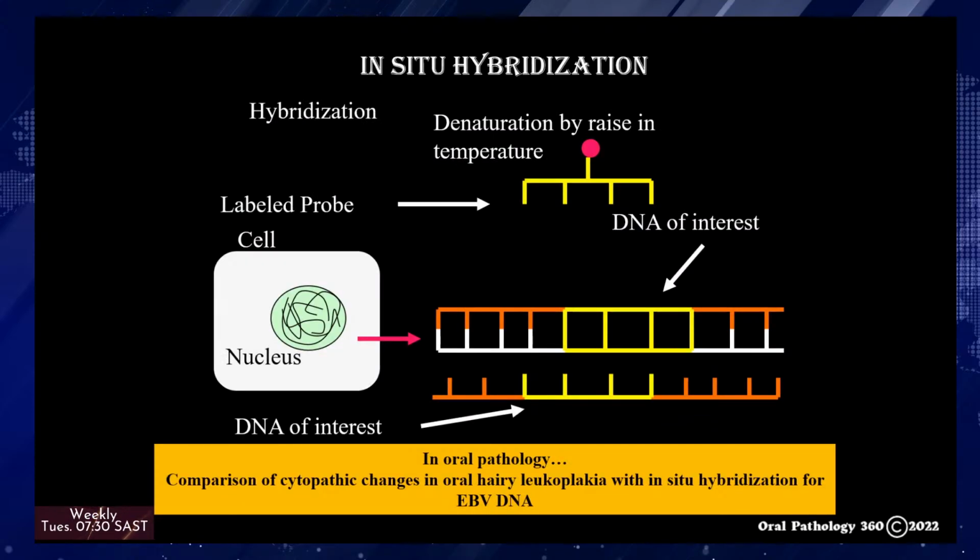In situ hybridization is a type of hybridization that uses a labeled complementary DNA or RNA strand to localize a specific DNA or RNA sequence in a portion or section of tissue, or if the tissue is small enough, in the entire tissue. This is distinct from immunohistochemistry, which usually localizes proteins in tissue sections. DNA in situ hybridization can be used to determine the structure of chromosomes.